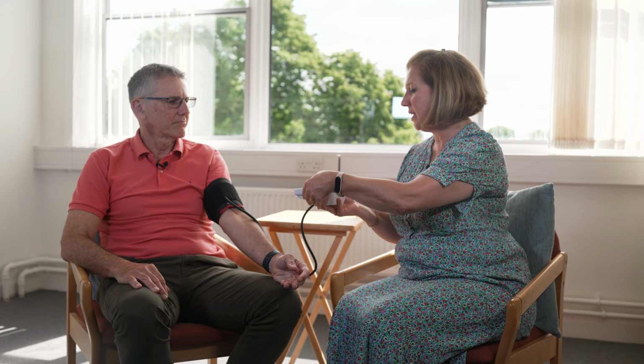So once the patient is resting and they are settled, hold the box level with the heart and press the start button and it will start to record. The cuff pumps up quite hard and for some people it's a strange sensation, so just bear with it because it is over within a few seconds. So while the blood pressure machine is working, I always ask the patient to sit quietly and rest, and hopefully we get a good recording this way.